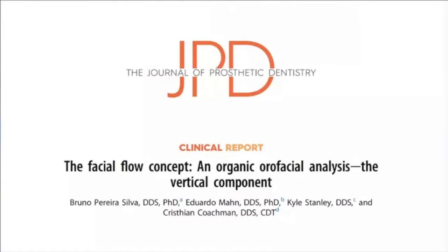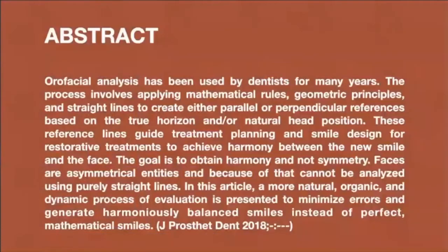And the study actually explained that for decades we tried to build or to plan new smiles based on straight lines in the face. We tried to apply mathematical rules to the face. We tried to apply straight lines in the face and calculate the smile based on these lines. But then we have a symmetric smile forced in an asymmetric face. So instead of trying to force symmetry into a face, we should obtain harmony. Then there is more than that. The face actually doesn't have a midline.